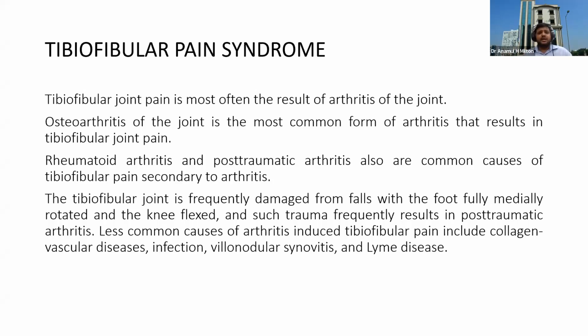I got a patient a few months back with very severe pain, and he was a Muslim. He could not pray in a sitting position. When I palpated and did an ultrasound, there was an outgrowth, and significant changes of the joint space in contrast with the normal side.